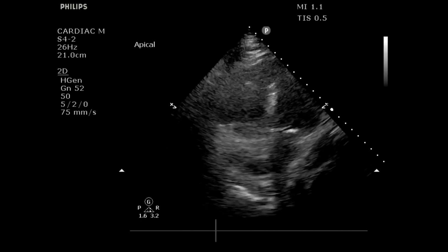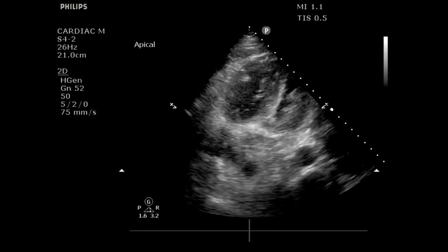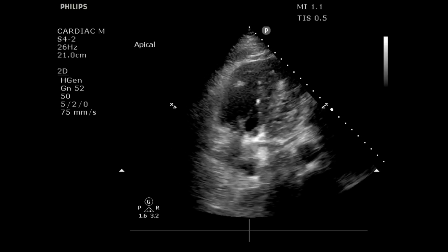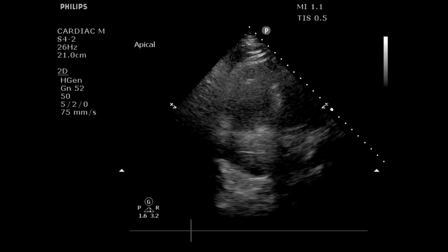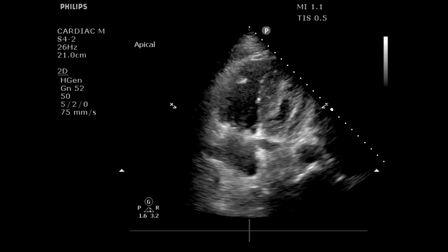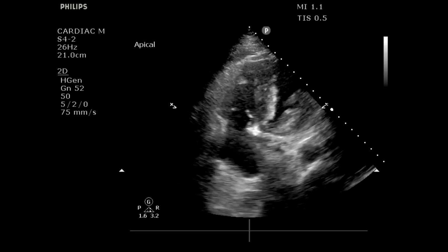And if we go to the apical four chamber, we can see our left ventricle and our right ventricle. And what we notice here is we've gone down the first two E's, the effusion, the ejection fraction. This one's a good one for equality. And what we're seeing in this window is that the RV seems to be a little bit bigger than it ought to be, right? We're going to say that's close to 1-to-1 in terms of RV, LV size, right?